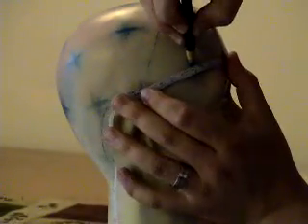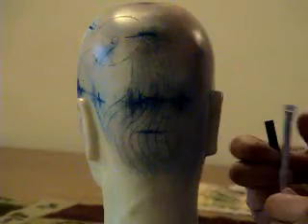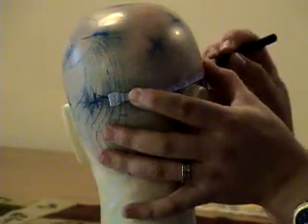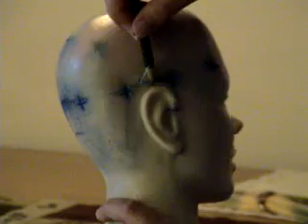And we're going to do the other side. 4.6, 4.6, 4.6, and again 4.6. You want to do the same again. Take your tape, place it, and make your cross marks. Now you can start to see a clear line all the way around the head.